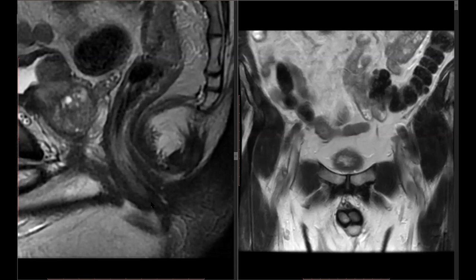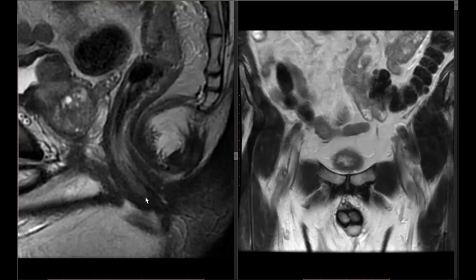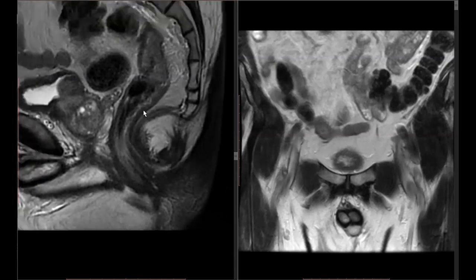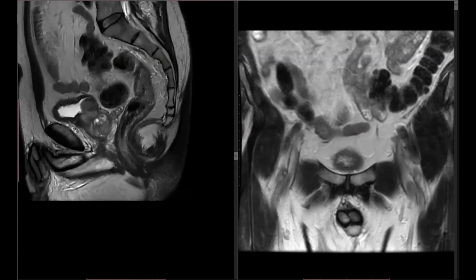It's important to have a dialogue with your surgeon or oncology team who typically care for rectal cancer patients to find out which definition they want you to use. At our institution, we use the most distal aspect of the anal canal rather than the most distal aspect of the internal sphincter, but there are other institutions that do use the internal sphincter endpoint. That's an important anatomic consideration to keep in mind.